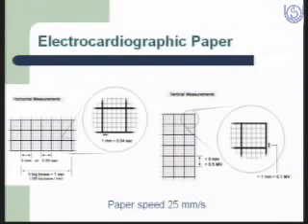So whenever you see an ECG, it is always a good idea to see at what speed the ECG has been recorded. Conventionally it is recorded at 25 millimeter per second, but at times the physician or the cardiologist may have ordered a special ECG when the speed may have been 50 millimeter or say 100 millimeter per second. So at the bottom of the ECG the paper speed is always written, which is conventionally 25 millimeter per second.